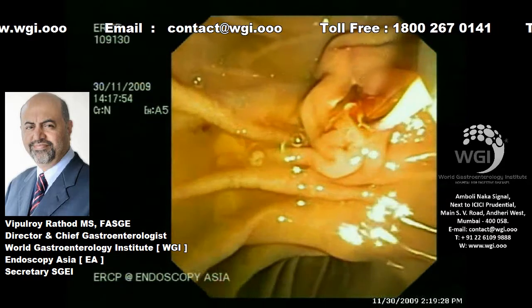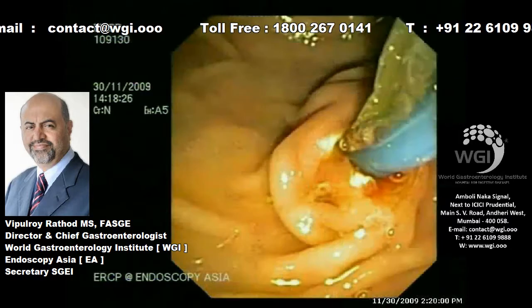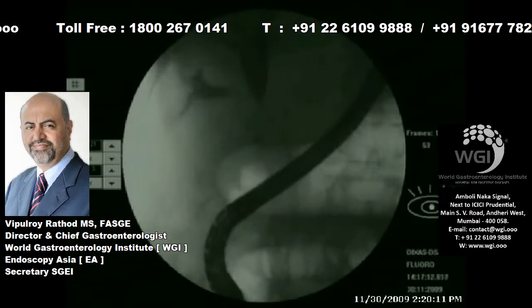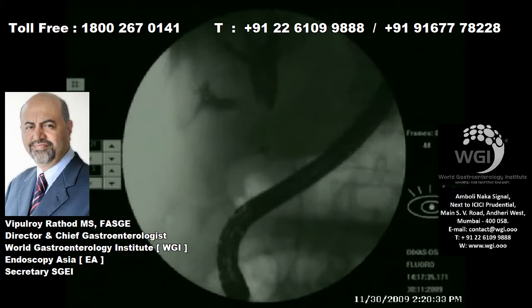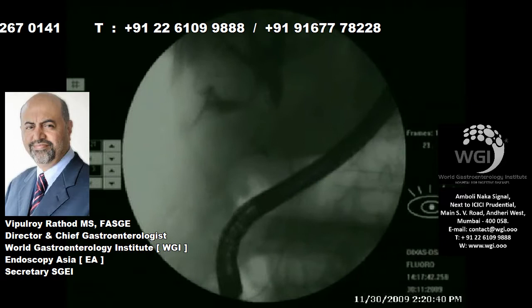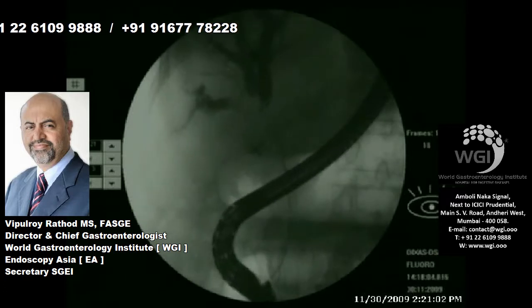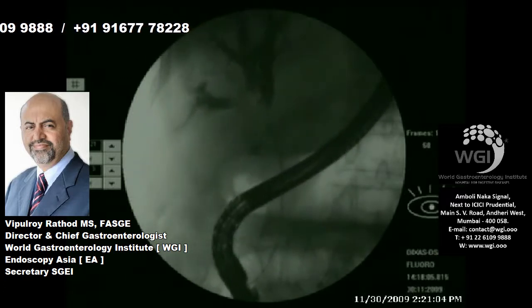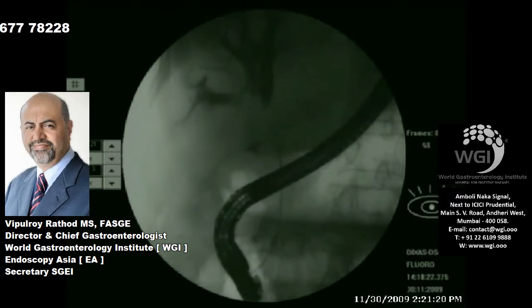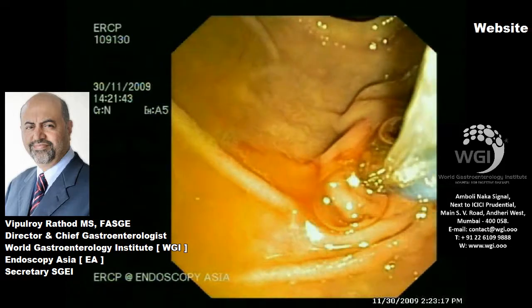Both the FNA material and the cytology material from the brush are sent for cytological examination. It is our practice to dilate the stricture with a balloon — we prefer to use a 6 to 8 mm balloon for such tight sclerotic strictures, which allows us to subsequently place two 10 French stents, one each in the right and the left ductal system at the primary intervention.